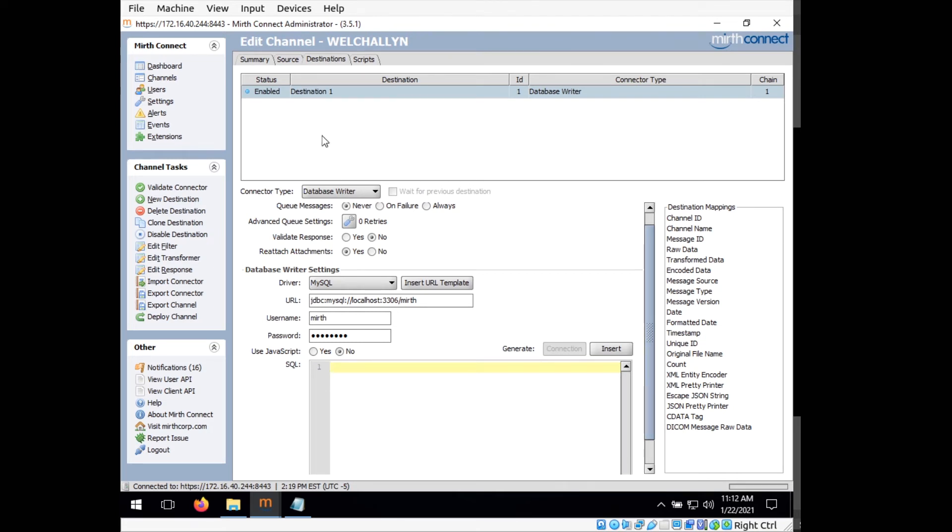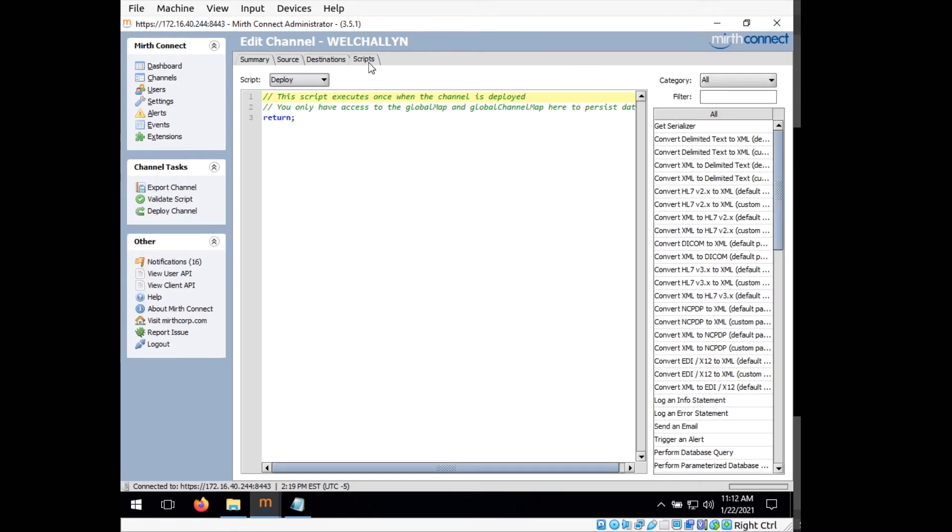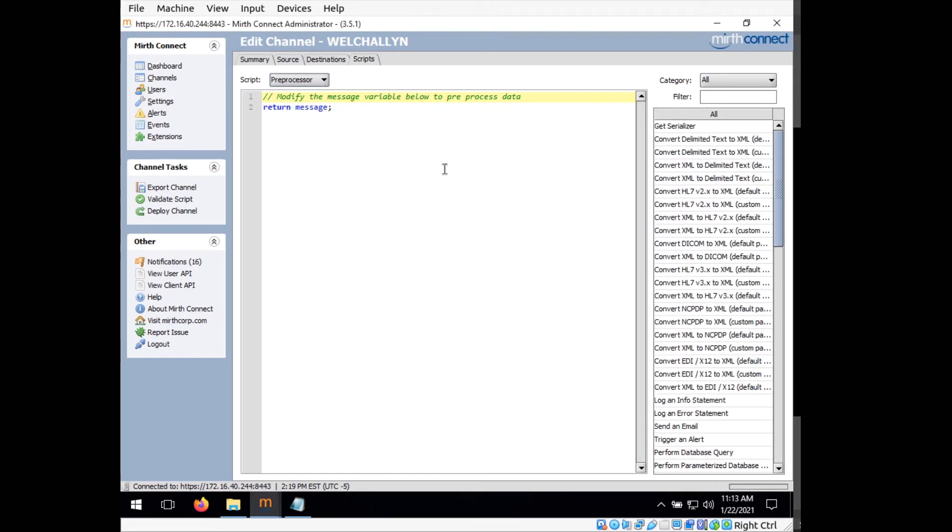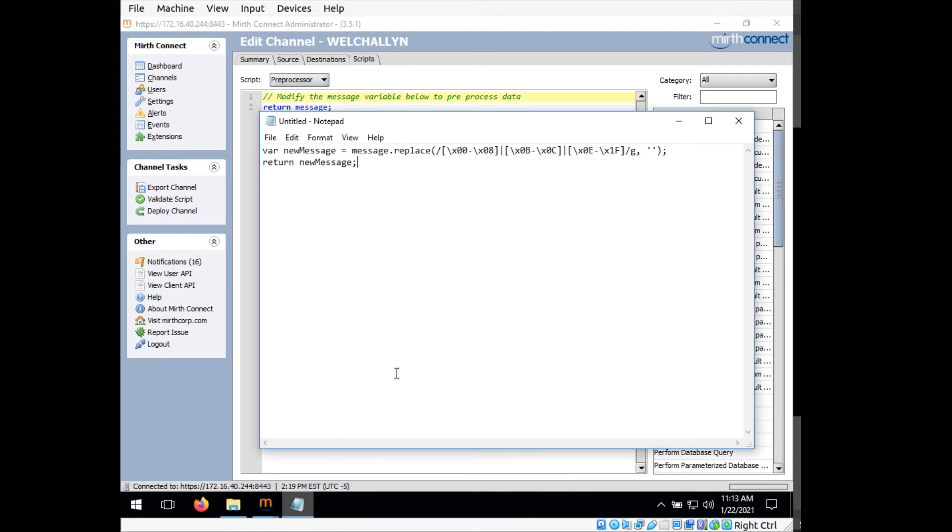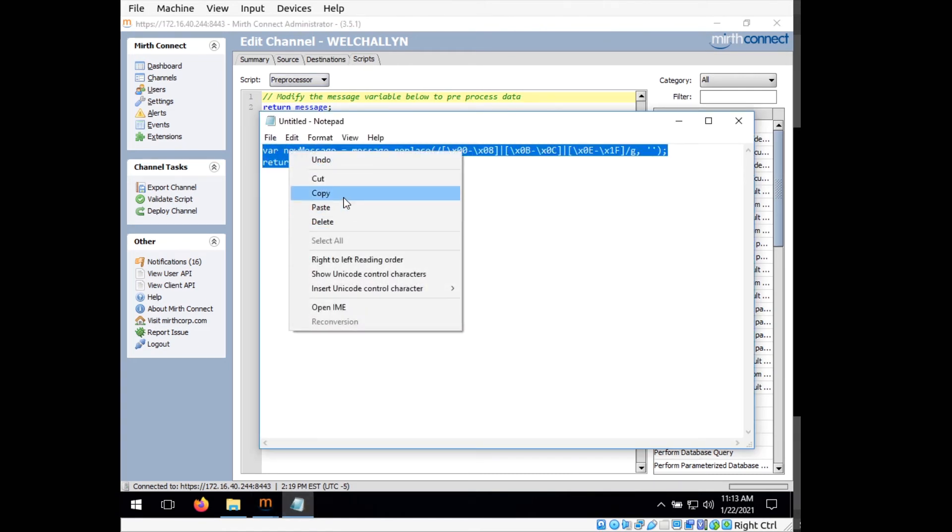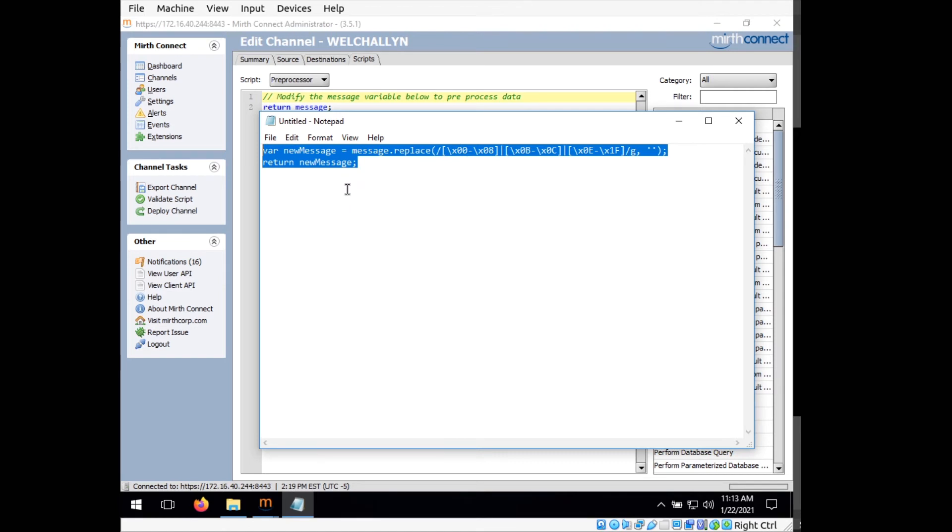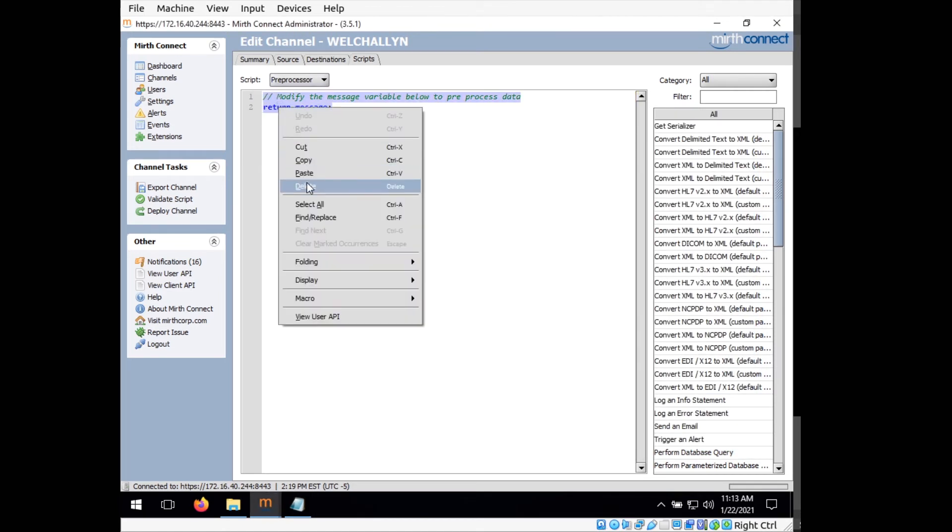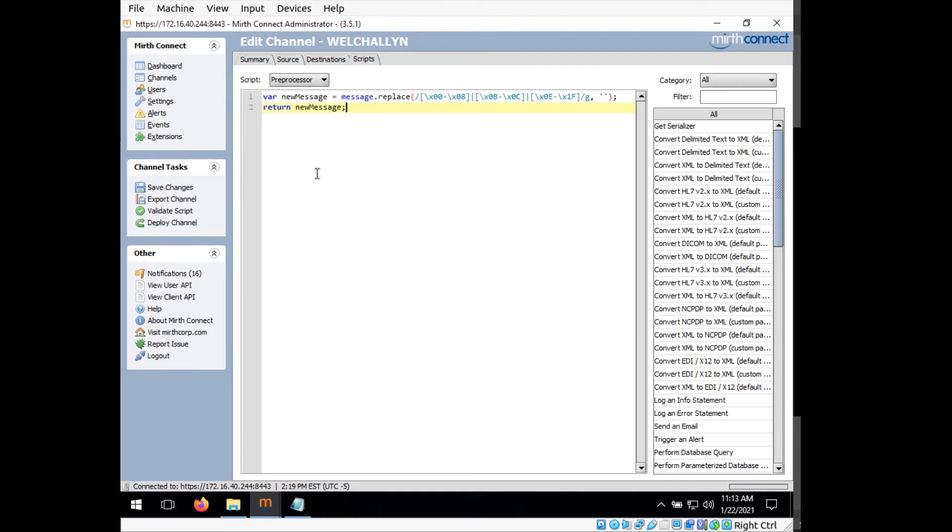So if you go up to the tab here called scripts, click on that and select from this drop down preprocessor. So there's a small snippet of code you need to replace this with. I'm going to copy it from our file here and paste it, select everything in this box and then right click paste to overwrite everything inside of this box. And what this will do is this will strip out some of the characters that give errors when this is going to be parsed.